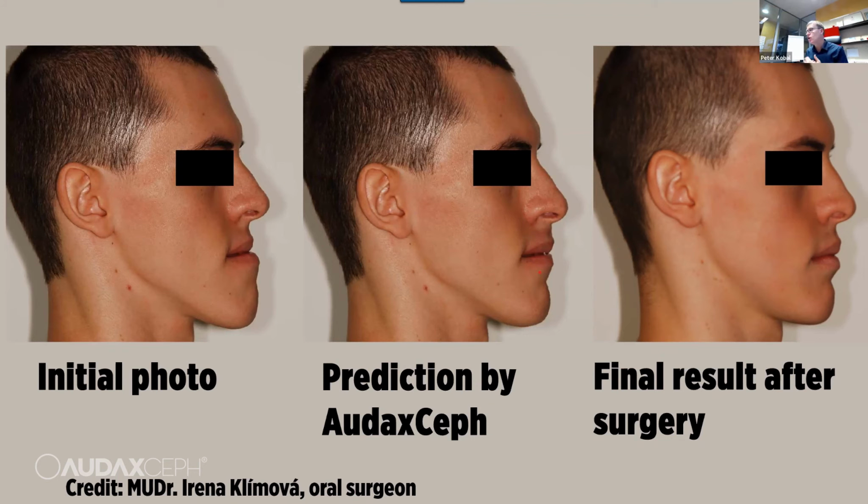If you show to the patient how they will look after the surgery, you need to know what you're doing. So don't use that if you are not sure that this will be the outcome of the surgery, because really different tissue behaves in a different way. And you cannot be sure: the same surgeon, the same surgery, and the outcome can be different.